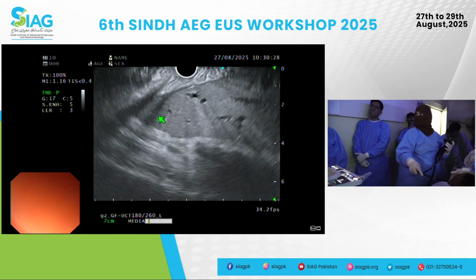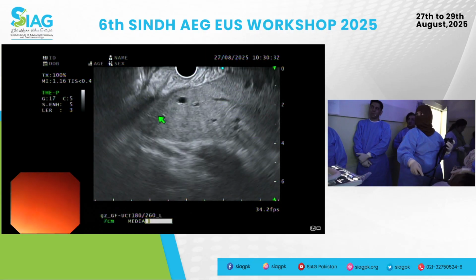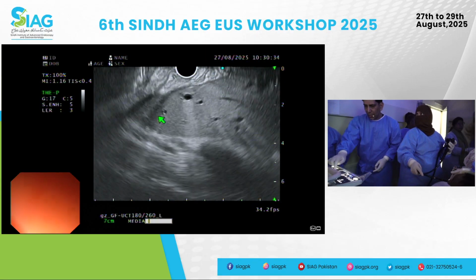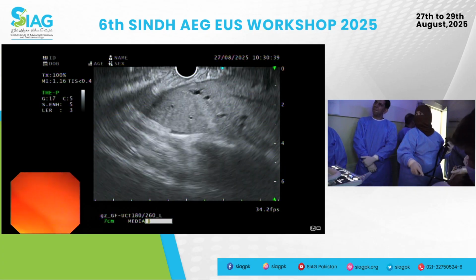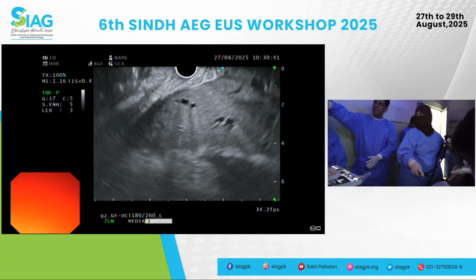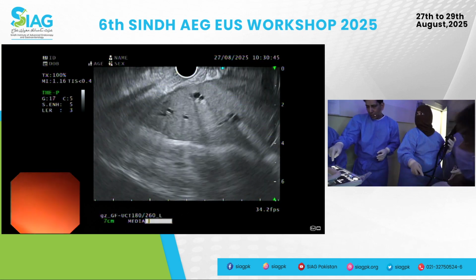Can you see? Can you appreciate any pneumobilia? Would you use your Doppler at all? Whitish. Remove the pointer please. I'm saying some of the ducts are whitish. Yeah, exactly. Absolutely. Nadeem, can you hear me? Yes sir. Will you use Doppler? Let's have a Doppler.